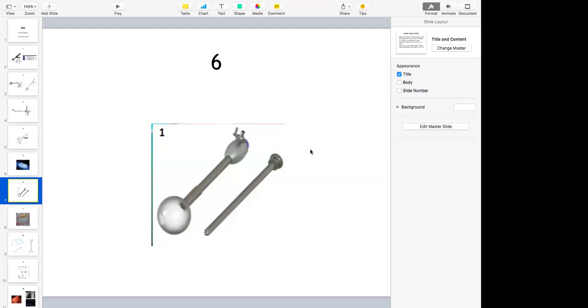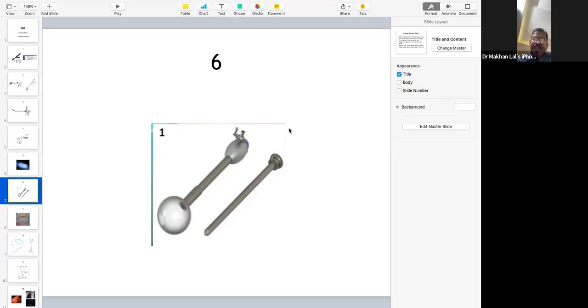What are the current settings being used in the CSSD, where there is a high burden of autoclavable items? Most hospitals have a central CSSD department. They do the whole hospital sterilization, where huge bulk is being sterilized.